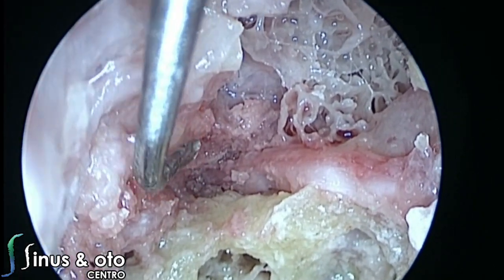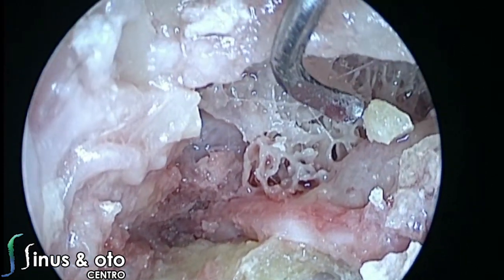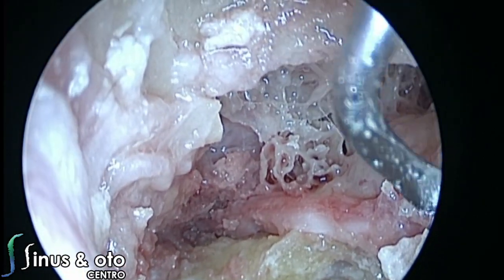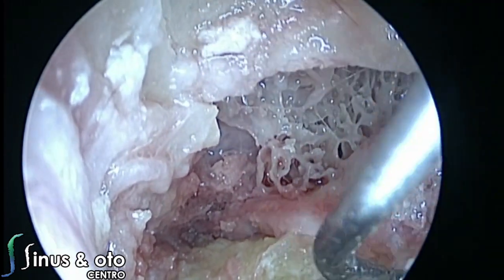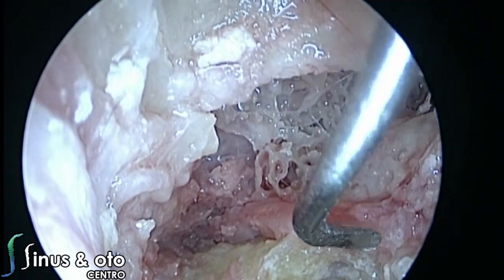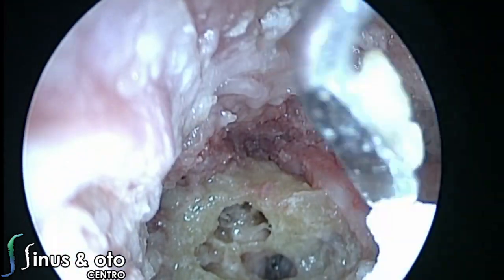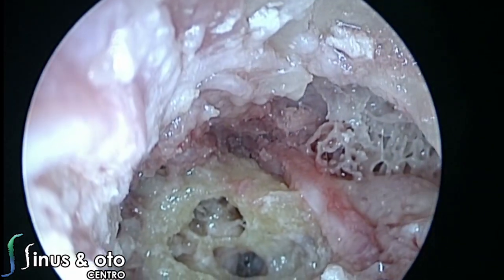Although they have the same name, they have different views according to the instrument and according to the approach that you use to follow them and to locate them. So the lateral semicircular canal is there, and if you angulate a little bit more, I bet we can see all the way to the mastoid tip. This is the facial recess, of course, and during this endoscopic view, you can see very nice anatomical structures and very nice anatomical positions.